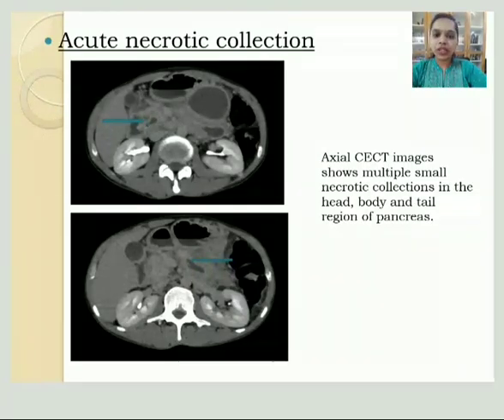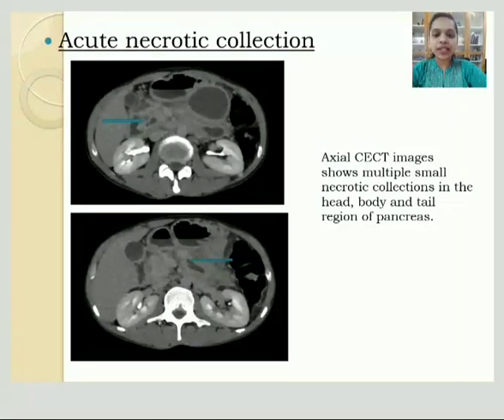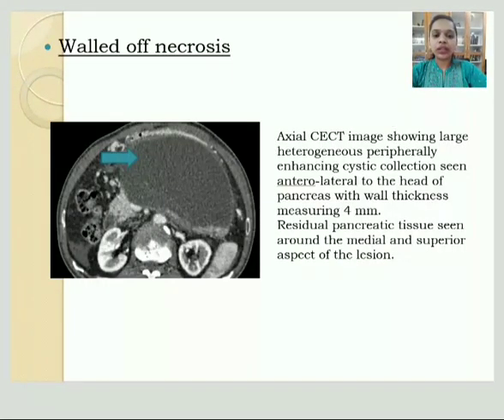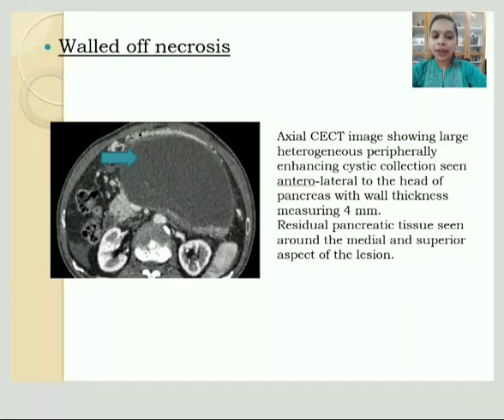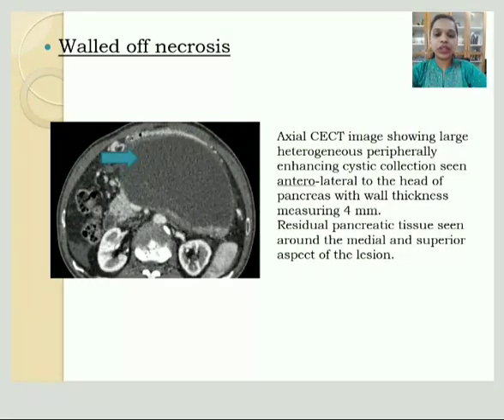Looking at representative images: here we have an axial CECT image showing multiple small necrotic collections in the head, body, and tail region of the pancreas, consistent with acute necrotic collection. Here is another axial CECT image showing a large heterogeneous, peripherally enhancing cystic collection in the anterolateral aspect of the head of the pancreas, with residual pancreatic tissue seen around the medial and superior aspect of the lesion, consistent with walled-off necrosis.